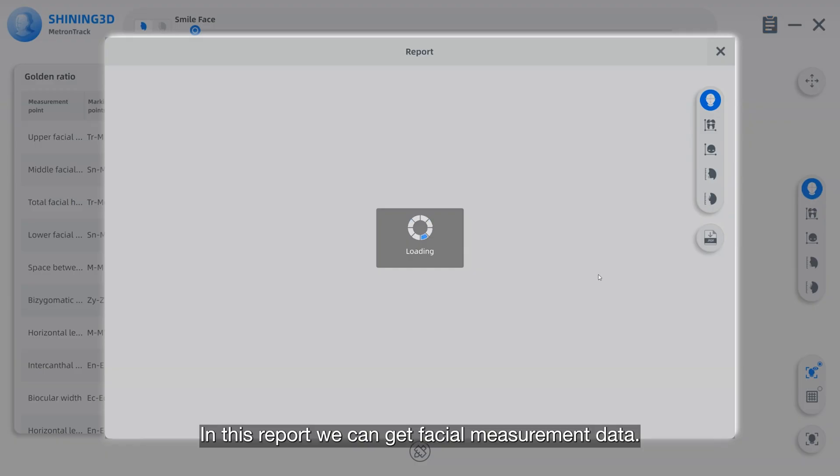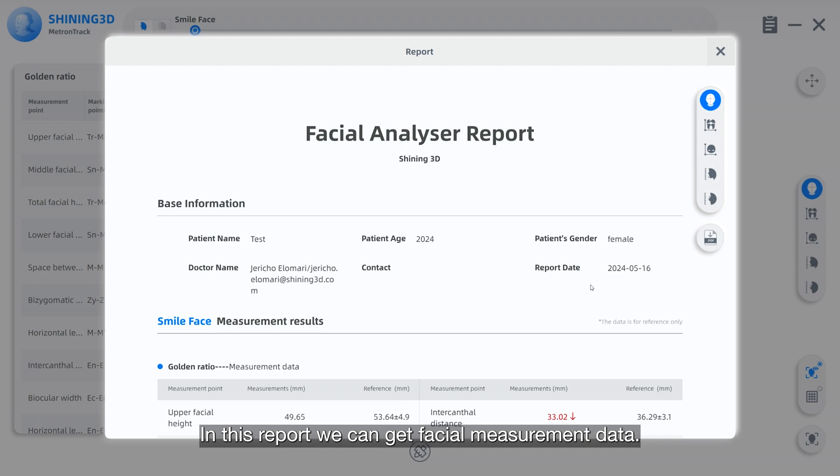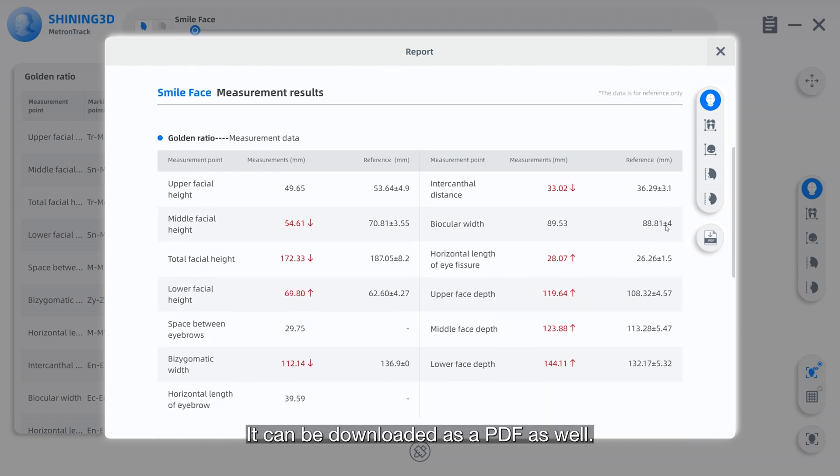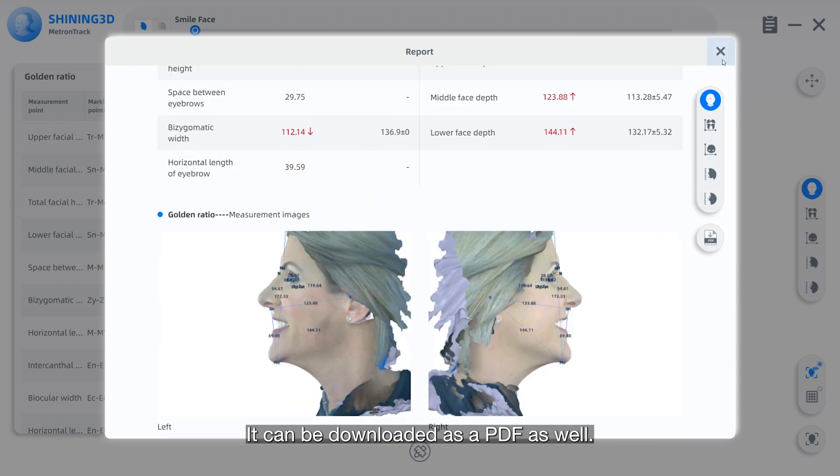In this report, we can get facial measurement data. It can be downloaded as a PDF as well.